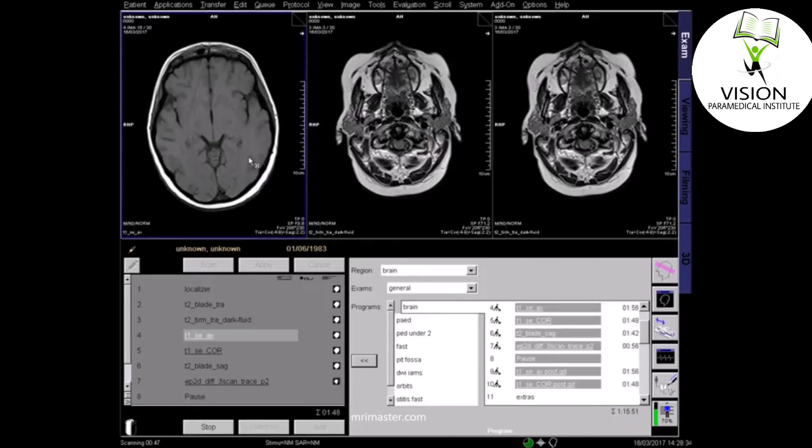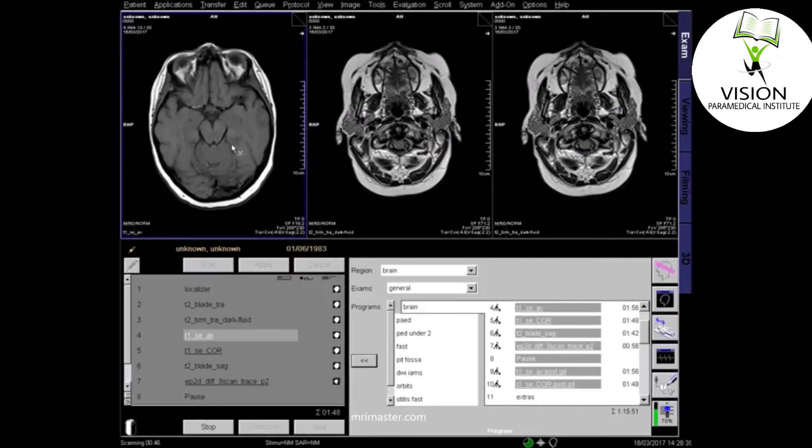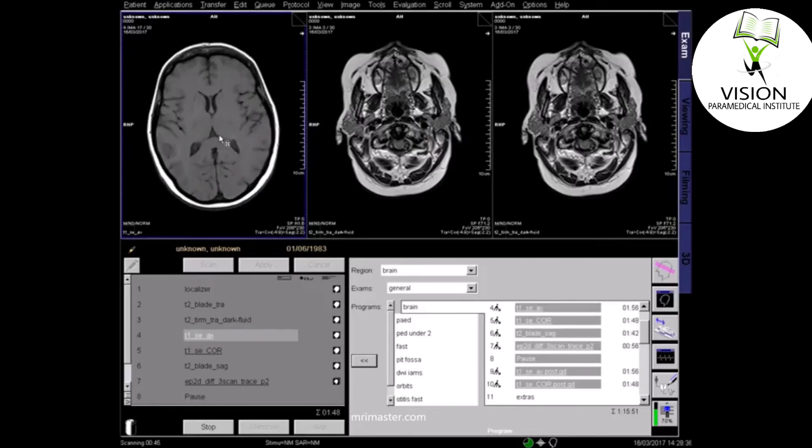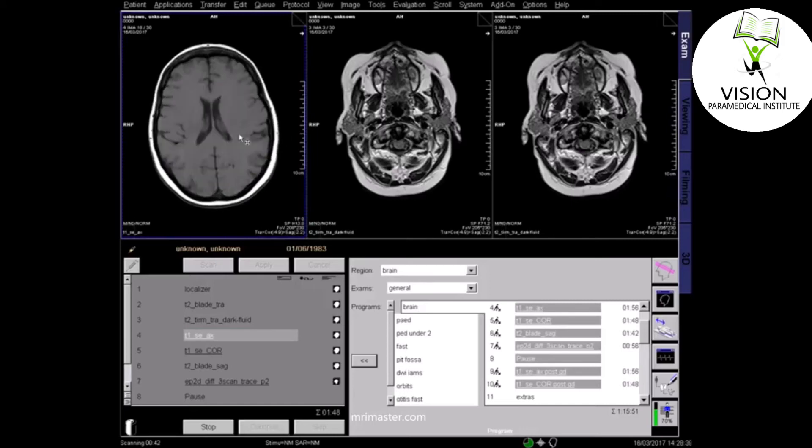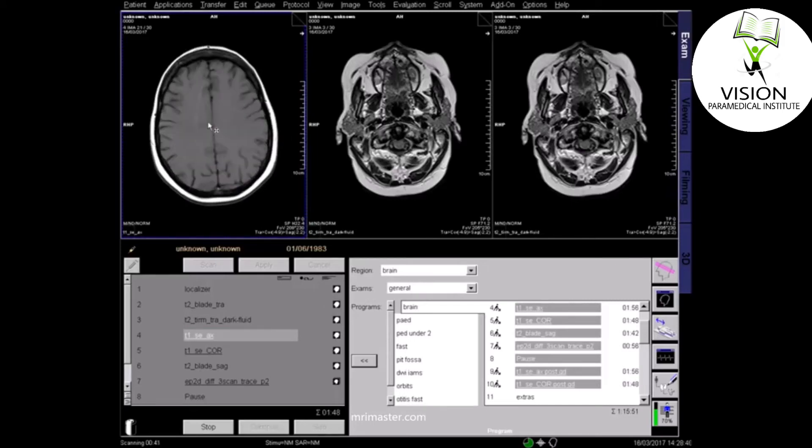On the T1 sequence, fluids appear dark, fat is bright, and most pathologies will appear dark.